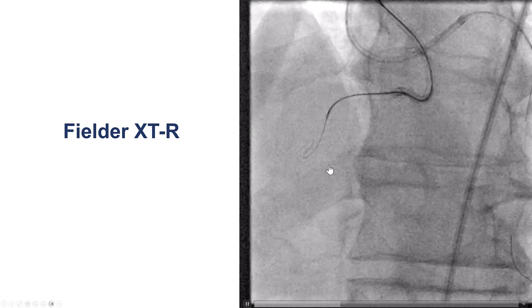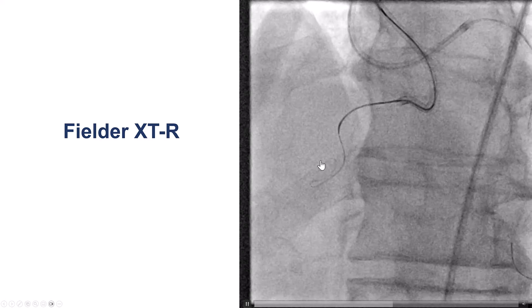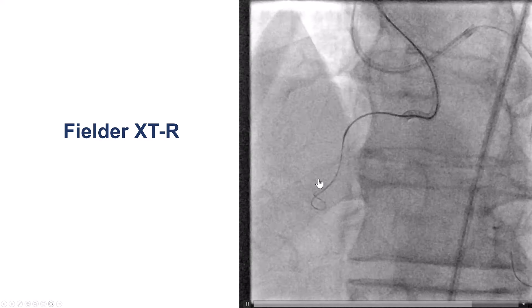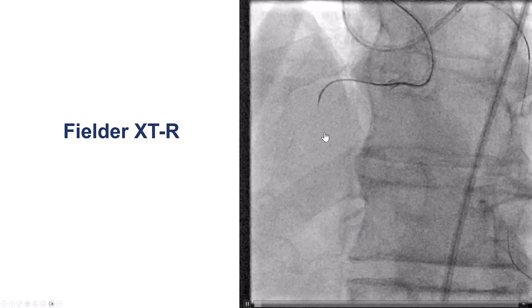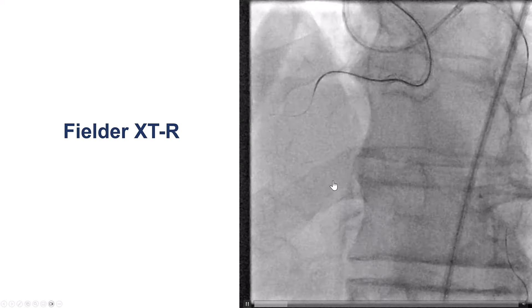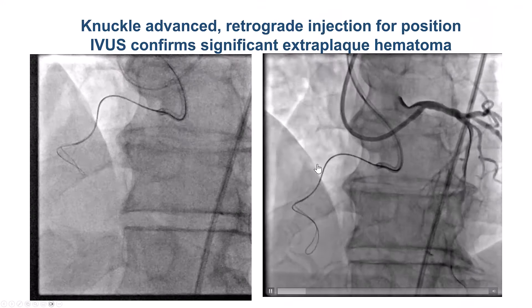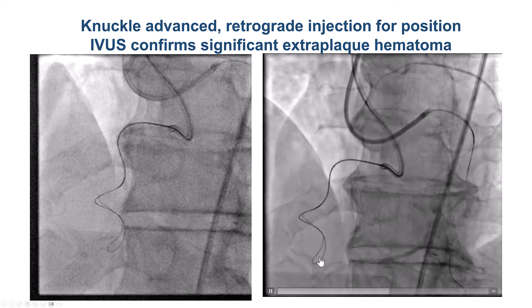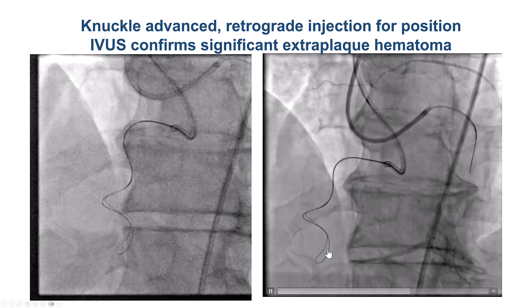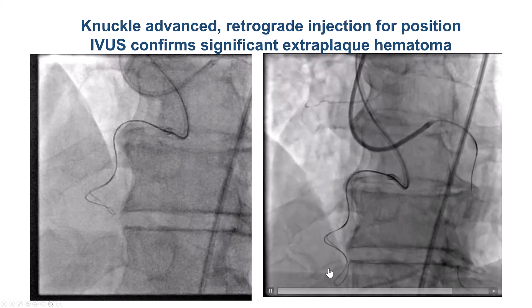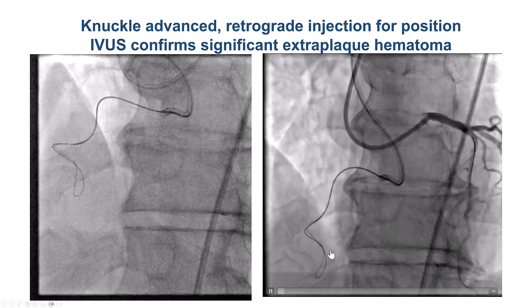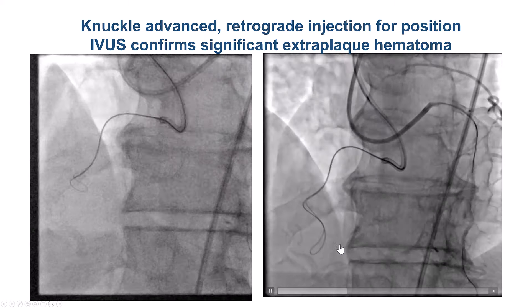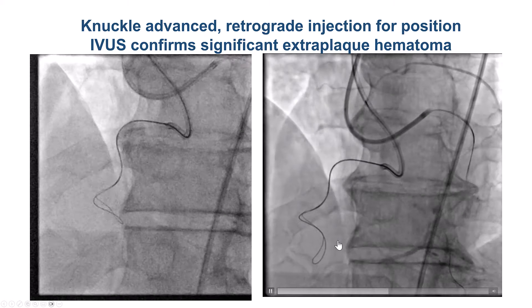Eventually we took the Fielder XTR and knuckled it, then advanced the knuckle along the area of tortuosity in the mid-RCA as we had seen with the coronary CT angiogram. There is where the wire is going, and it looks like we were in the distal RCA past the bend in the mid-RCA, although this didn't look perfect in terms of the location of the lesion.